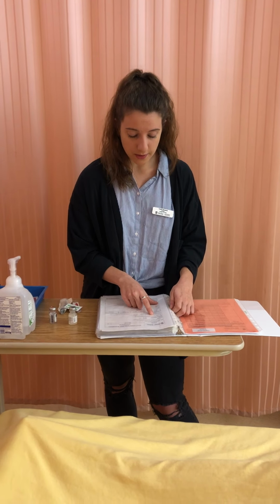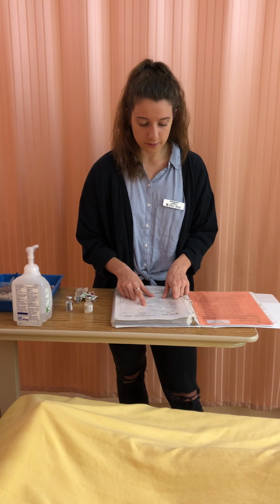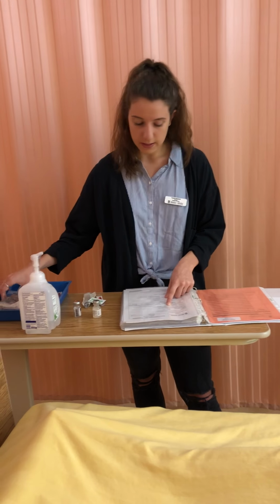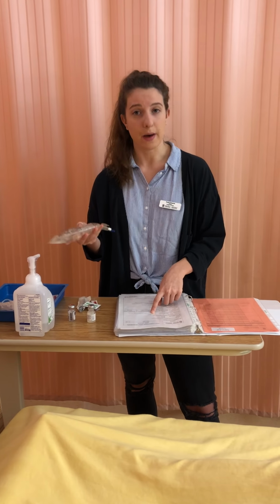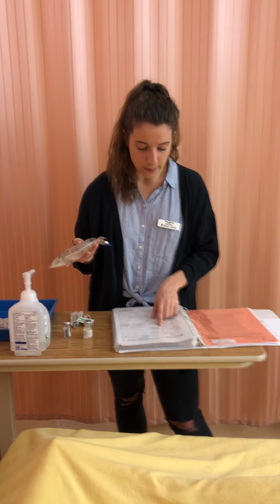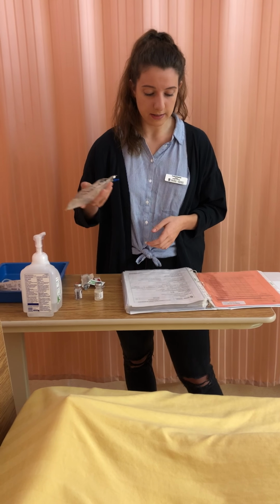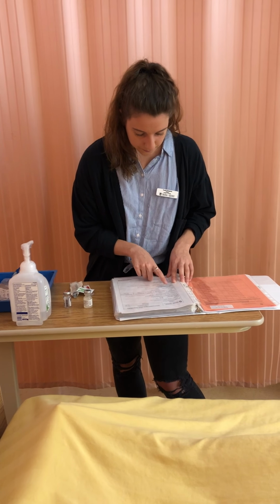It is supplied as a 500 milligram vial, and I will be adding 4.8 milliliters of sterile water for injection for a final volume of 5 milliliters and a final concentration of 100 milligrams per milliliter. I will then further be diluting in a 250 milliliter bag of normal saline. I chose normal saline here because it's compatible with the primary that's hanging. Also, my patient doesn't really need any nutrients, and I chose 250 instead of the 500 because my patient doesn't need 500 mLs. The 250 is a fine volume to give, and I will be giving it over 1 hour. I'm going to inject it into my spring.